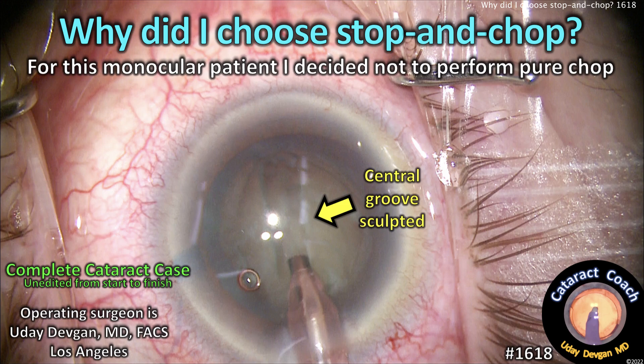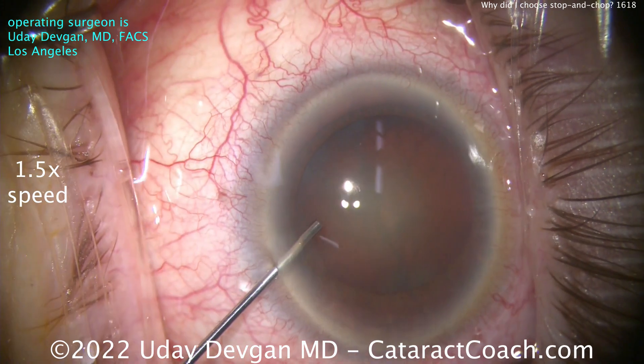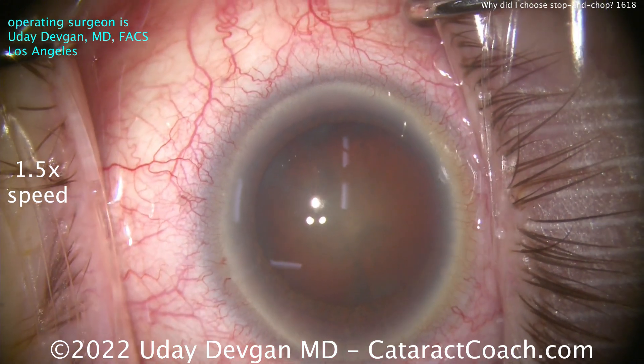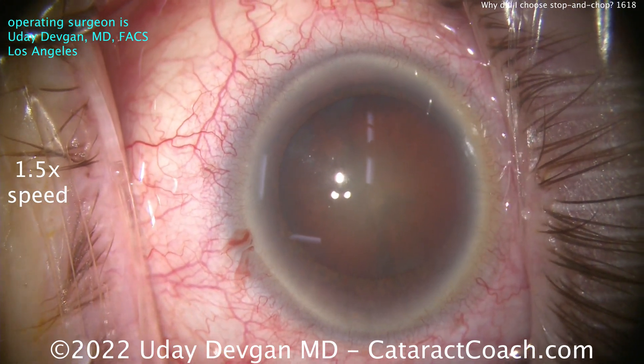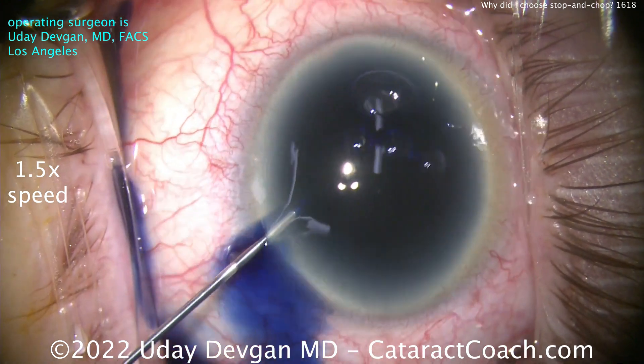CataractCoach.com. Why did I choose stop and chop for this technique? It's a monocular patient and I decided not to perform a standard phaco chop technique. I'm going to show you the case unedited start to finish — sped up about one and a half times normal speed. A little bit of trypan blue dye; we're going to stain this lens capsule.